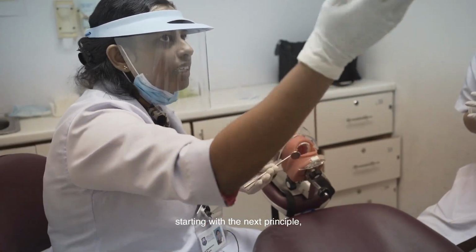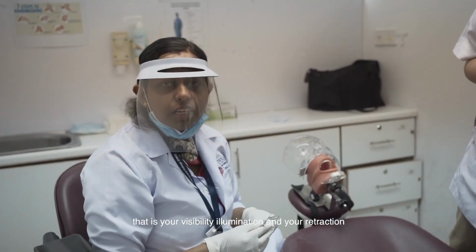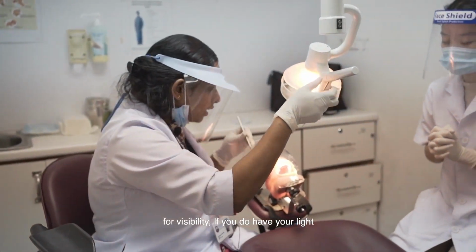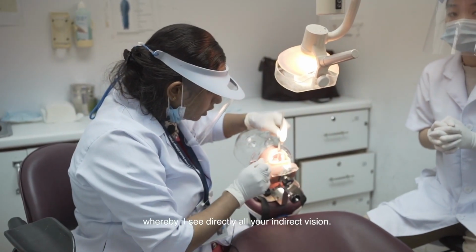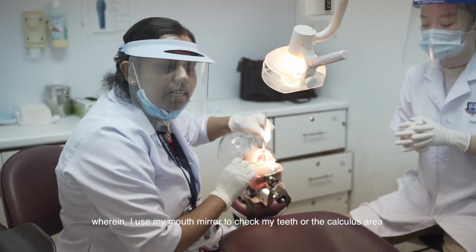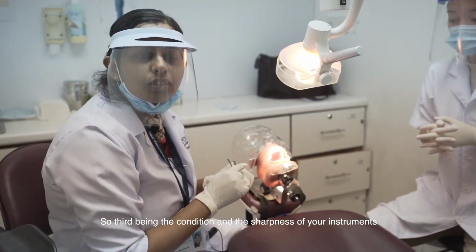Starting with the next principle, that is your visibility, illumination and retraction. For visibility, you do have your light, wherein you have your direct vision, whereby I see directly, or your indirect vision, wherein I use my mouth mirror to check my teeth or the calculus areas. Third is the condition and the sharpness of your instruments.